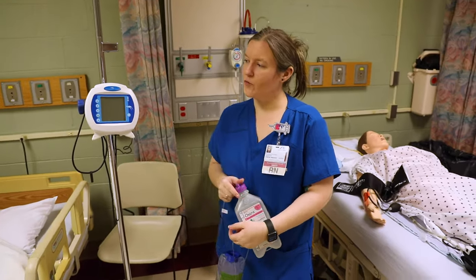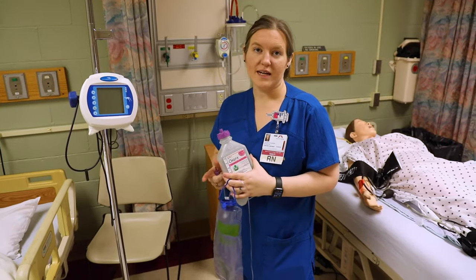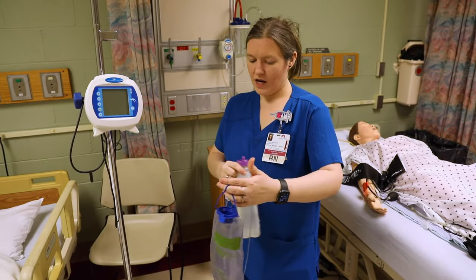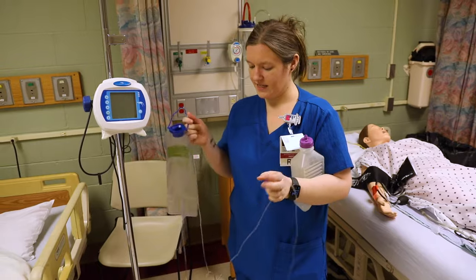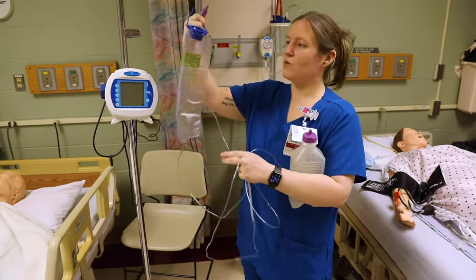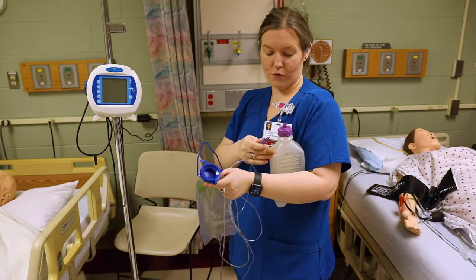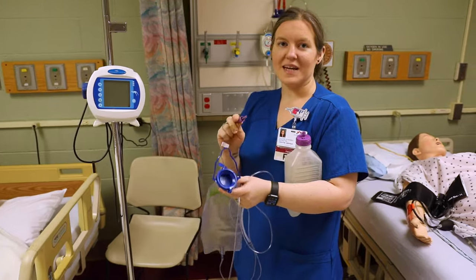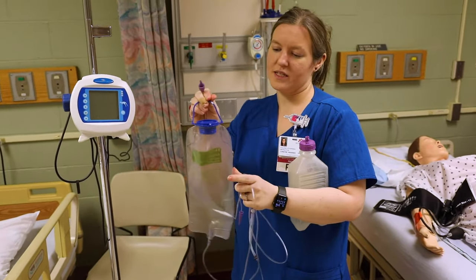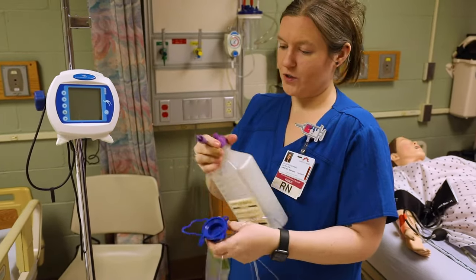I'm going to show you how to set up a Kangaroo pump, or feeding tube pump. What you're going to need is the formula that has been ordered for the patient, and you're going to need a set that goes with the Kangaroo pump. There are two different kinds — this one has a bag for fluid and a spike to put in with the formula if the formula is in cans, or if it's going to be poured into a bag, you just need the set that has two bags.